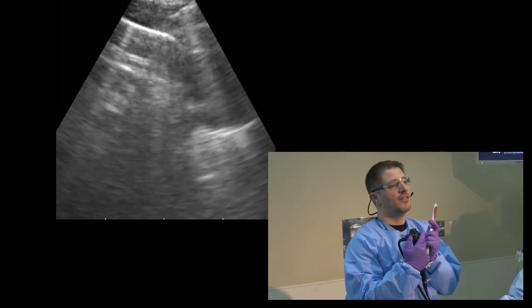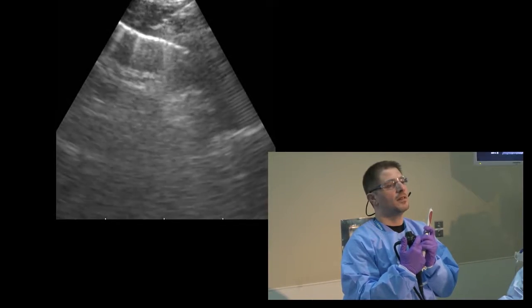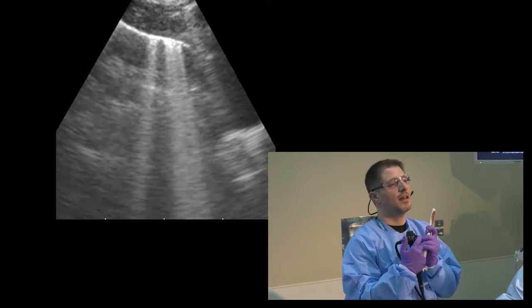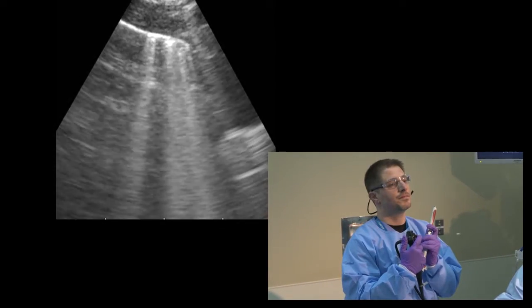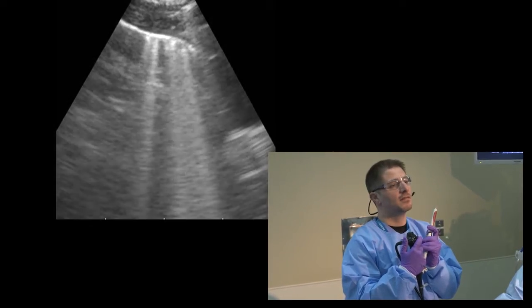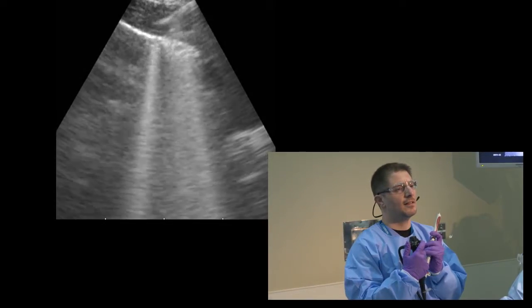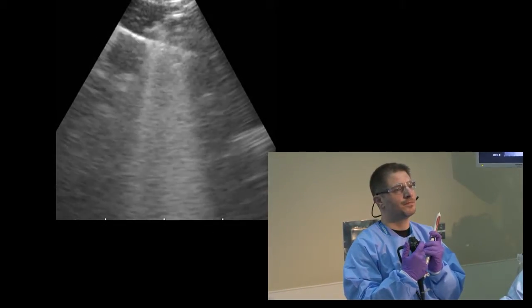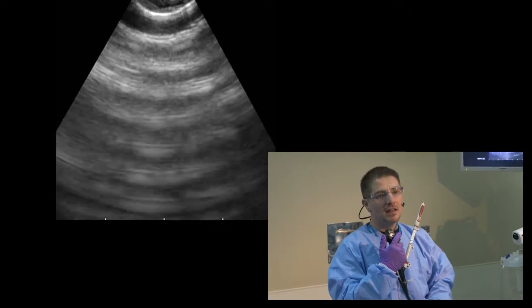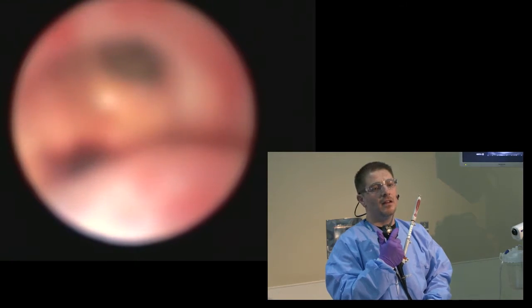We'll pull the stylet halfway and do the sample. The sample should be from edge to edge of the lymph node to guarantee getting maximum amount of tissue. The first sample will go for slide for on-site cytological evaluation. So 11L is the lymph node again between the left upper lobe and left lower lobe in that carina.